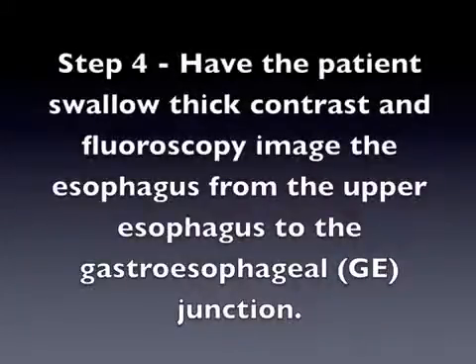Step 4. Have the patient swallow thick contrast and fluoroscopy image the esophagus from the upper esophagus to the gastroesophageal junction. Tell the patient that you will count to 3 and have them swallow on 3. Begin fluoroscopy when you count to the number 2.